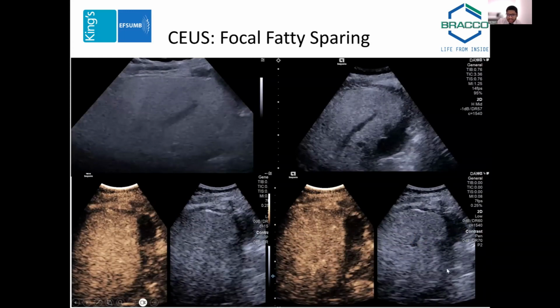And here's a slide I added just now, because this was an interesting case that I just scanned. Here's a patient where it's very difficult to see through such an attenuating liver. But again, the world is changing. These are the cases where it would have been said, send to CT, send to MRI, because we can't exclude something. Well, now you've got much better penetration. You've got an ability to see things much deeper than you ever used to.